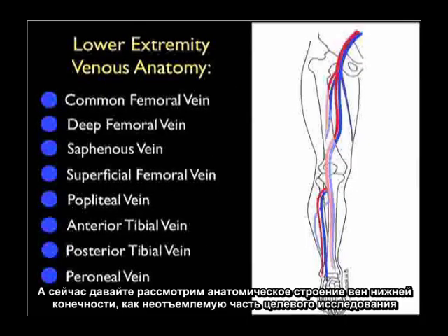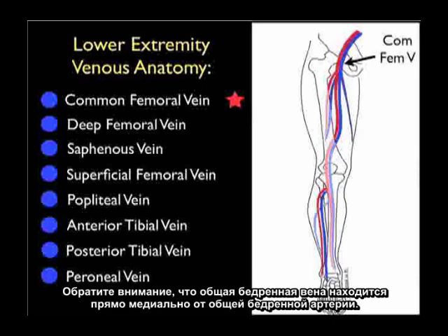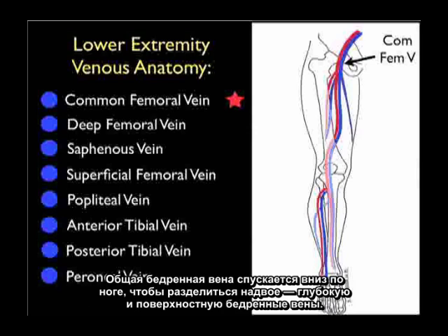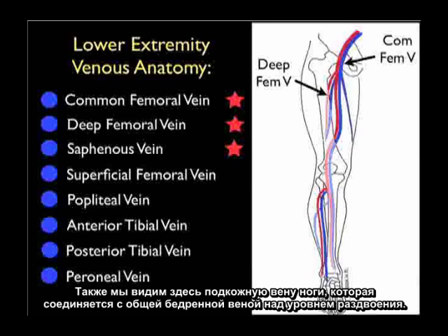Let's now review the lower extremity venous anatomy integral to performance of the focused DVT examination. We begin by identifying the common femoral vein, seen just below the inguinal ligament, just medial to the common femoral artery. The common femoral vein continues down the leg to bifurcate into the deep and superficial femoral veins. We also see here the saphenous vein, which joins into the common femoral vein above the level of bifurcation.